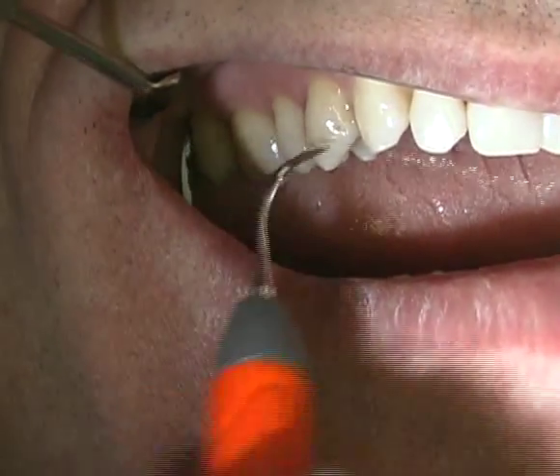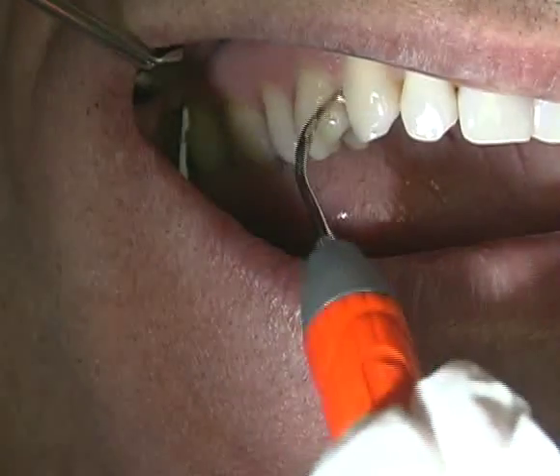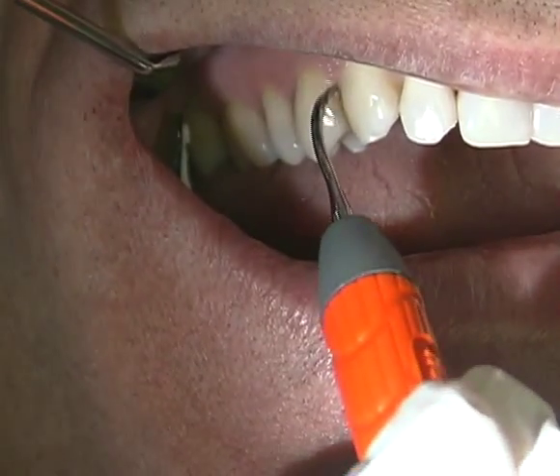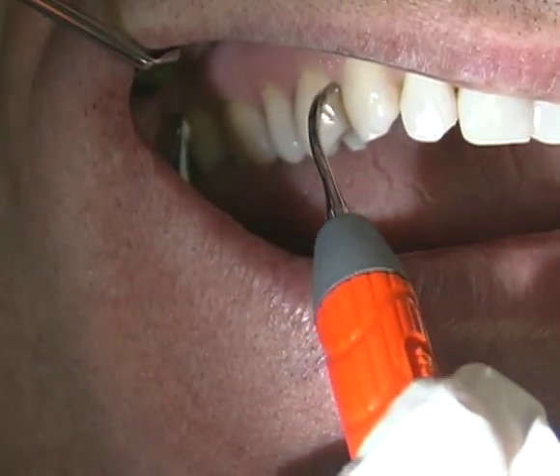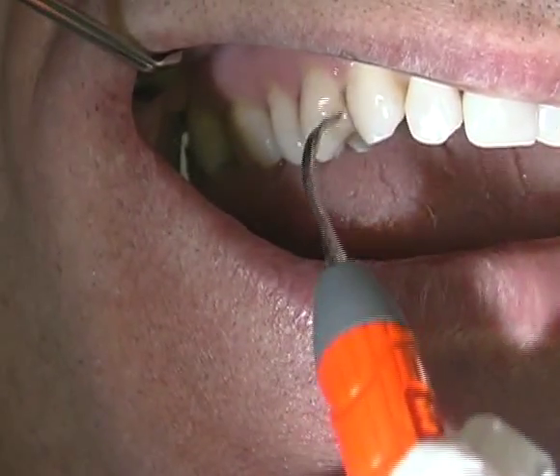Multiple strokes from various directions are often required to break up and remove tenacious deposits. Use this tip on medium to high power, paying careful attention not to over-instrument on root surfaces when using higher power settings.